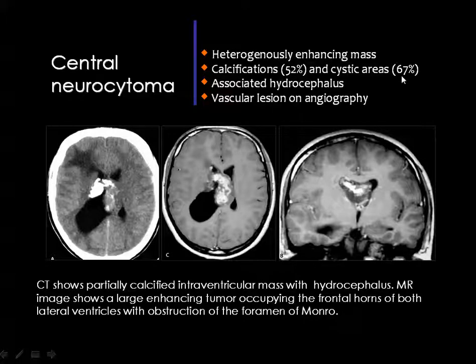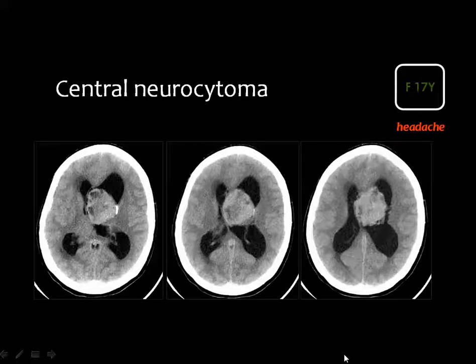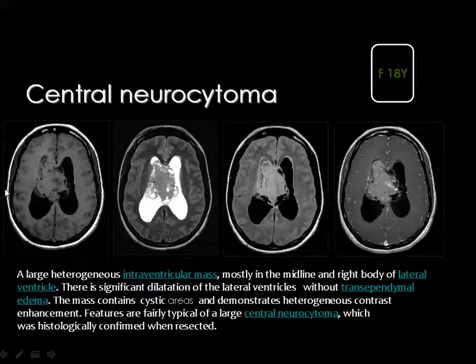The tumor is heterogeneously enhanced, and it contains calcium, of course, and it contains a cystic component in about 70% of cases. Then if you see a mass inside the ventricle which has a real cyst, not an area of breakdown, a real cystic component, then you think of the central neurocytoma. If you look here carefully, you can see these internal areas of cystic degeneration within the tumor in a patient who is 17 years old, which is around the age of 20, then you suspect the possibility of central neurocytoma. And this is the classic appearance of the central neurocytoma with cystic component, which is better seen in these images, in the enhanced image and in the FLAIR image as well. And the cystic components are also seen here clearly in the T2 weighted image.